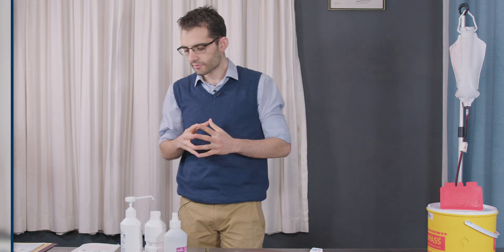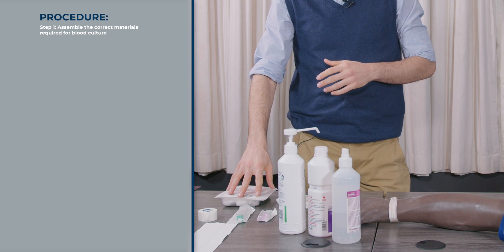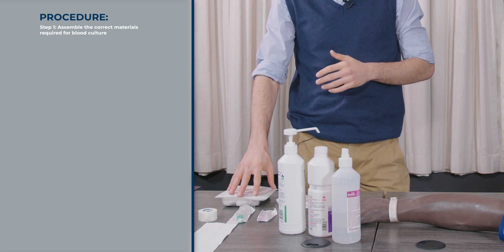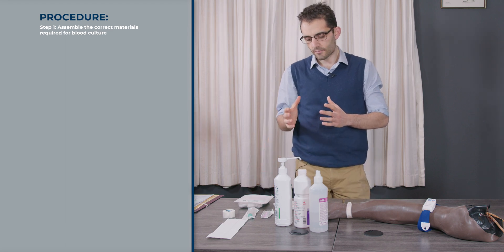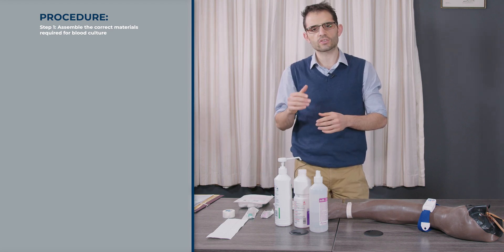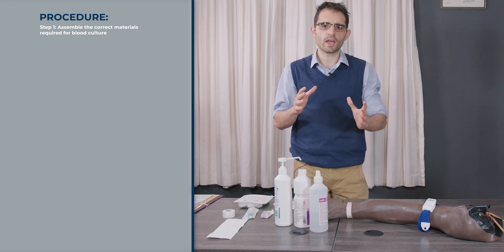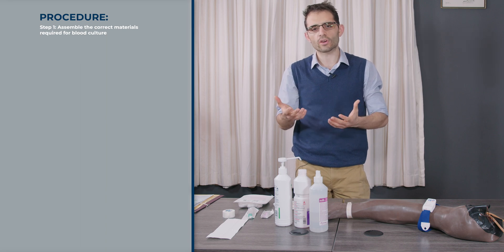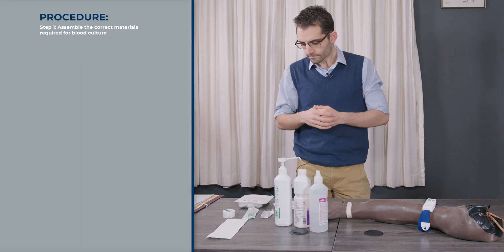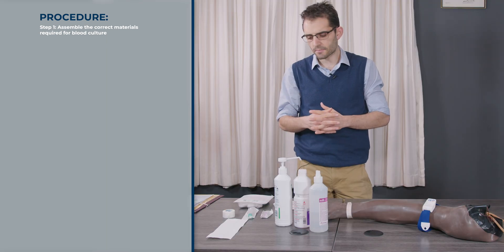There are a few things that you need to have. One of them is your blood culture sterile pack. If you don't have that, you could use a dressing pack. Then you'll need a 10 ml or 20 ml syringe. The best is to put in 10 ml into the blood culture bottle, because that is the ratio needed for the medium as well as for the blood. If you put in too little, your yield of picking up the microorganisms will be reduced. Then you'll need your needle — whether it's a 21 gauge or 22 gauge, it doesn't really matter.